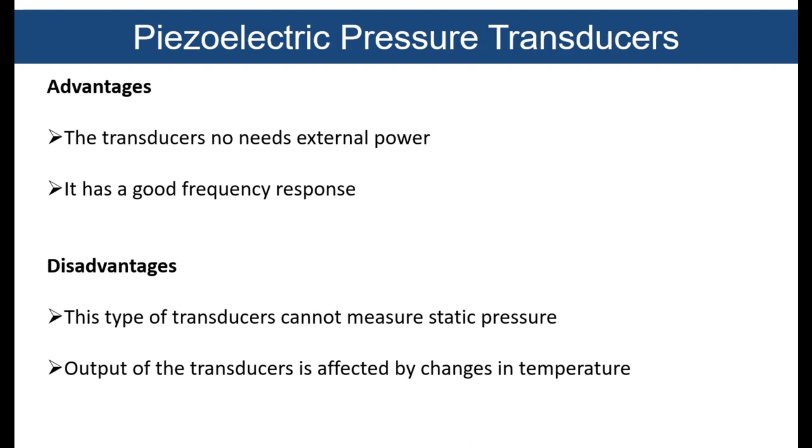The output of the transducer is affected by changes in temperature, as we have seen in the strain gauge pressure transducer and the reluctance pressure transducer. This piezoelectric pressure transducer is also affected by temperature change. So over here also, the output is affected by the change in temperature.